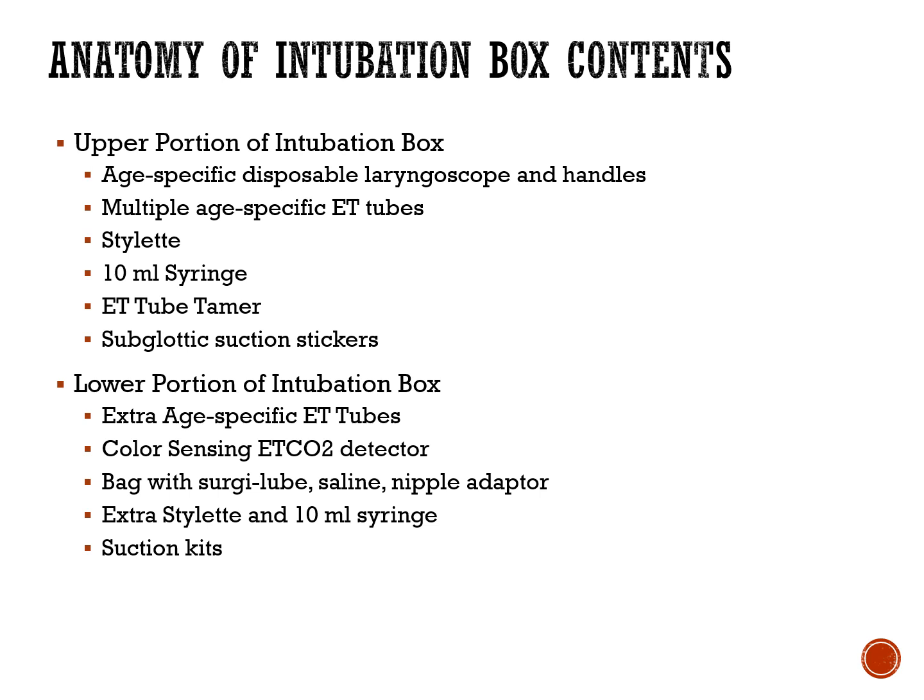Multiple age-specific endotracheal tubes. I say that because if you have an adult intubation box, they tend to go down to as low as a 6.0. And if you need anything less than that, because you could have somebody who's 25 years old, but their body habitus is that of an 8-year-old, then you'd be best to ensure that you have a pediatric intubation box. And even in our adult units, we absolutely have at least one pediatric intubation box there.